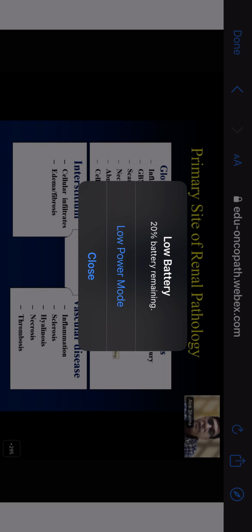So when you actually look at a renal biopsy, the first step is to look at it at low power, just like any other histology. First you go from low to high power, try to ascertain where the pathology is, right? Of course, you will have an idea by looking at the clinical history, which is essential here. If there is proteinuria, you know you have to focus on the glomeruli. If there is minimal proteinuria and a lot of renal dysfunction, you know you have to focus on the tubulointerstitium. If the patient is severely hypertensive and other things, then you need to focus on the vessels. So clinical symptoms will direct you where to look, but you have to look for everything at the same time. These are the things you usually look for in each and every case, in varying orders or varying time spent, right?